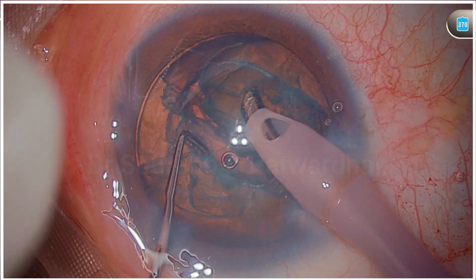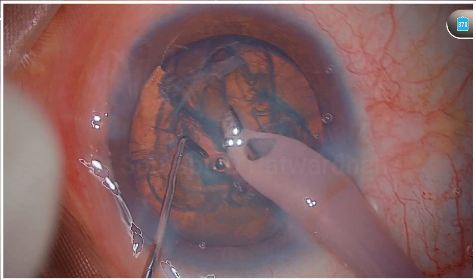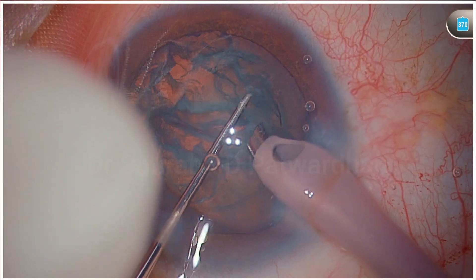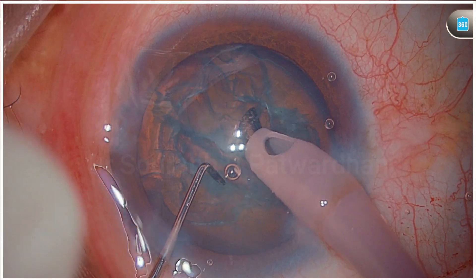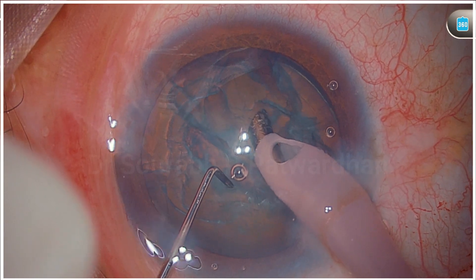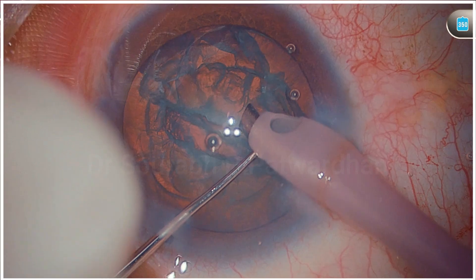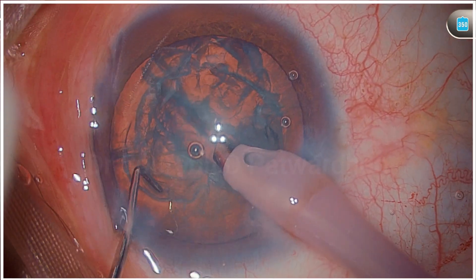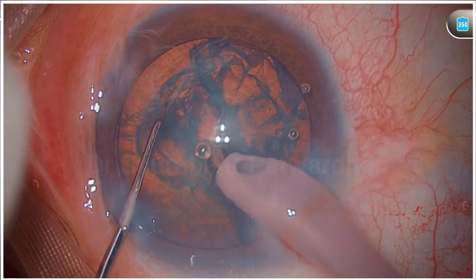Here I am trying to aspirate out one hemi nucleus which I have divided. But you can see that because the hydrodissection is incomplete, I find it very difficult to take this hemi nucleus out. If I continue to do this, it is a risky maneuver — trying to pull out the nucleus from the bag without proper hydrodissection essentially puts stress on the zonules, and I want to avoid that. So I think this is the time where I must repeat hydrodissection.